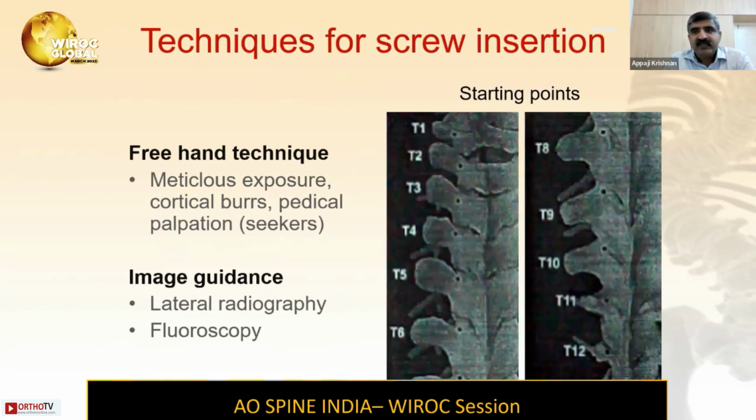There are 2 techniques of insertion. One is a freehand technique. The second one will be image guidance, like lateral and anterior fluoroscopy. The freehand technique requires meticulous exposure. We require cortical burrs and pedicle palpation seekers.